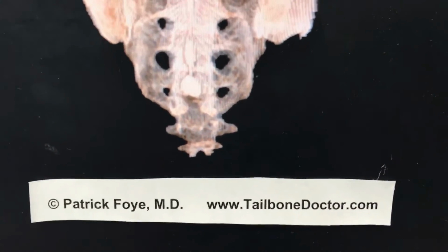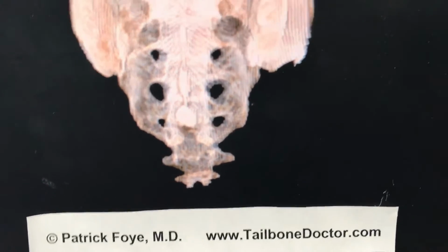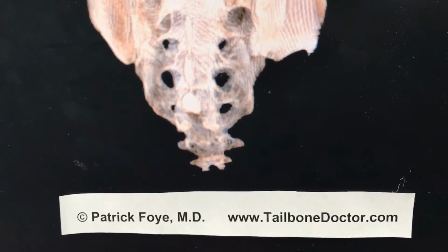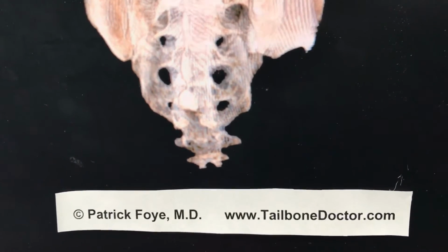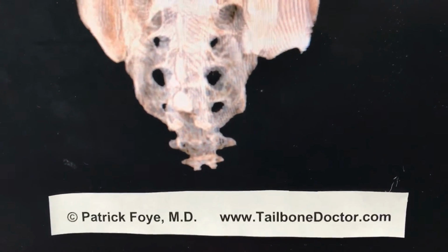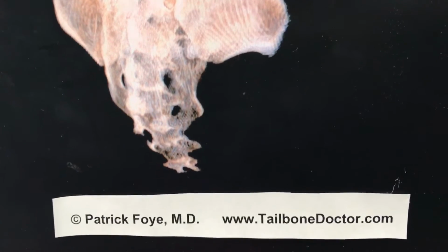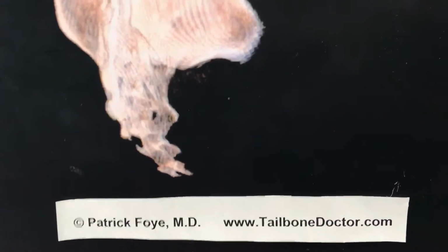So that becomes really interesting and important, because in some patients, if we see anatomic variations, if we're not sure why we're not seeing the tailbone appearance in the typical fashion in the lower part of the coccyx, one of the things that physicians would be concerned about is whether this may represent a malignancy, a cancer of the tailbone region, such as chordoma, which unfortunately is highly fatal.